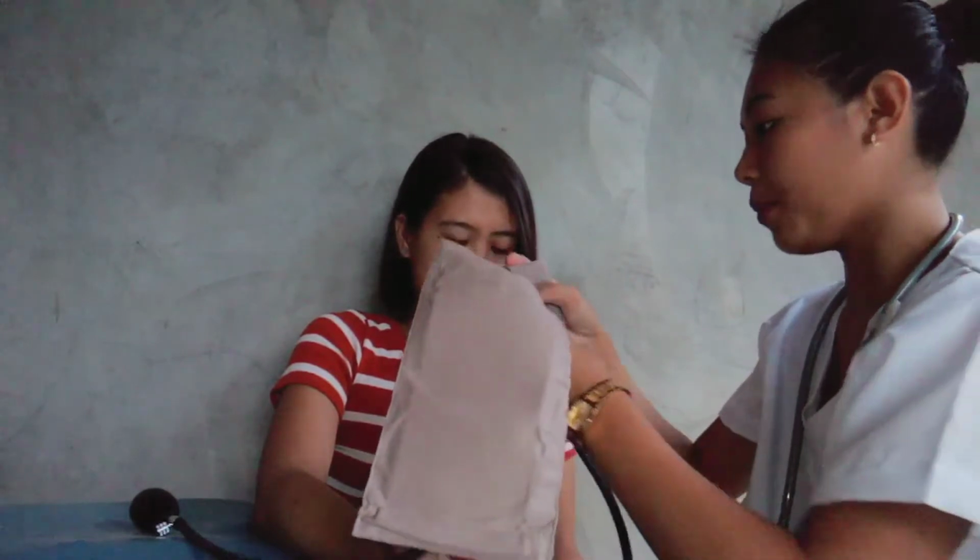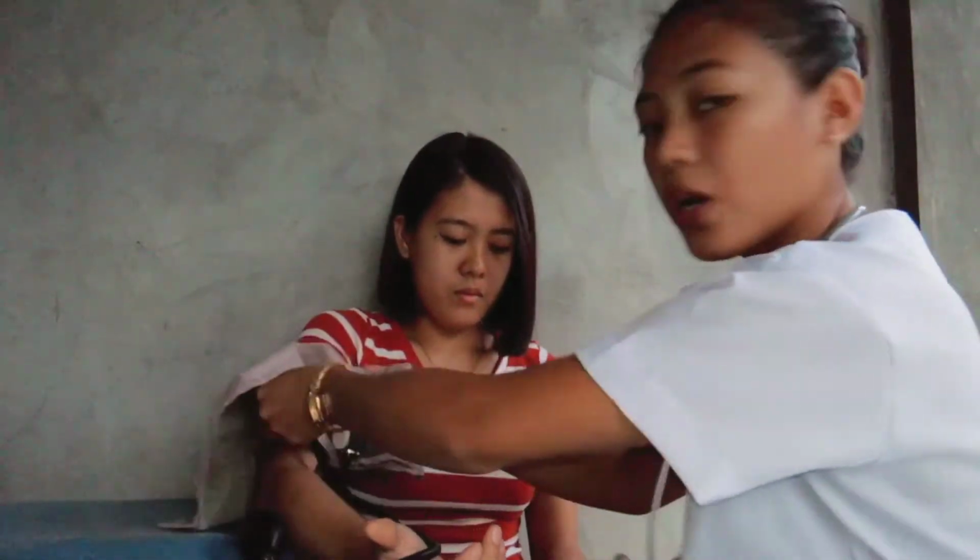First, make sure that her arm is at her heart level. After that, the next thing to do is find her brachial artery. Next, let's now put on the cuff.